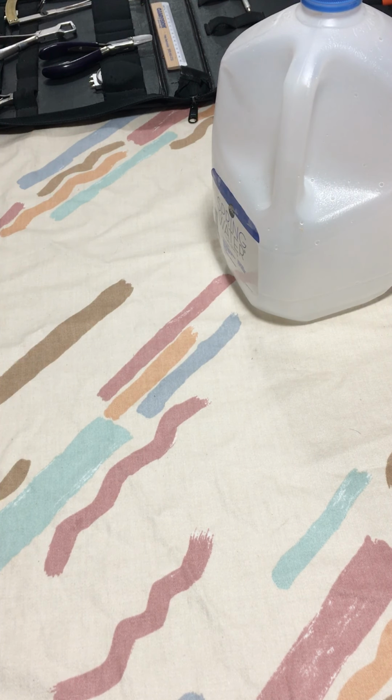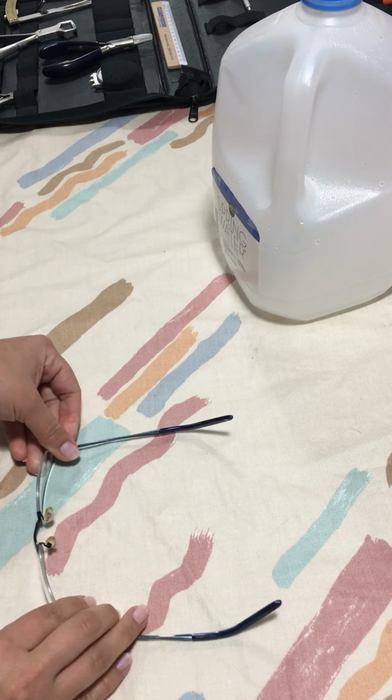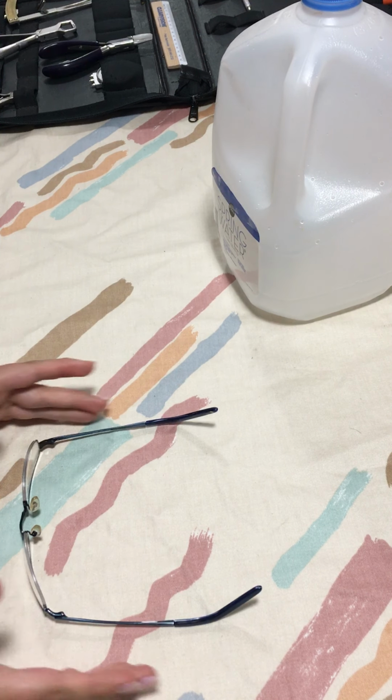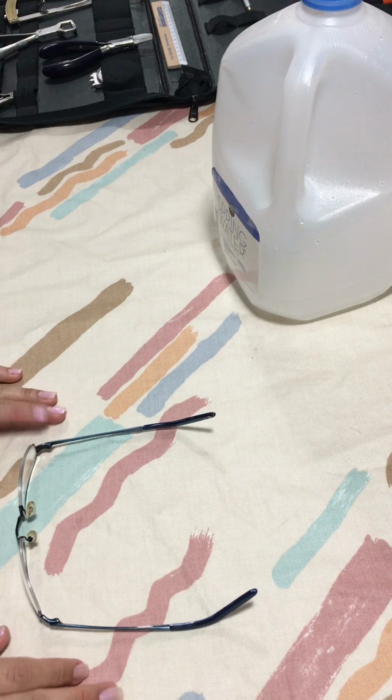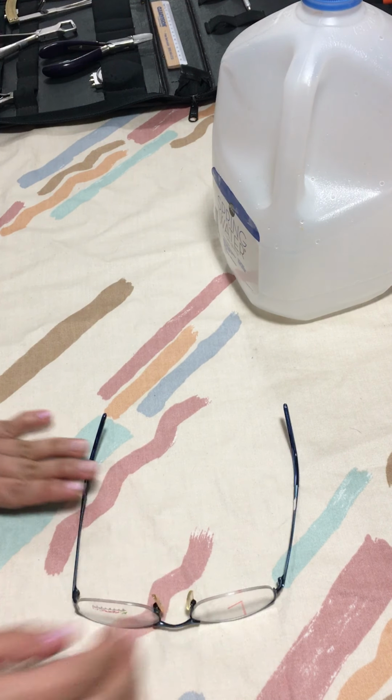On the next misalignments, we're going to be working on temple misalignments. We're going to be identifying temple misalignments on the patient, how to identify them and how to correct them. The first temple misalignment that we're going to be working with is going to be the temple spread. So with the temple spread, just by looking at the frame, I noticed that this temple is more outwards than this temple. This is camera view.